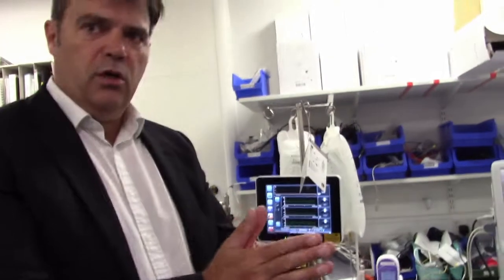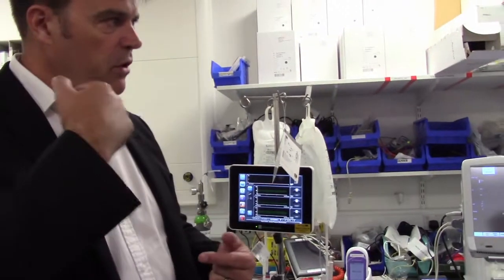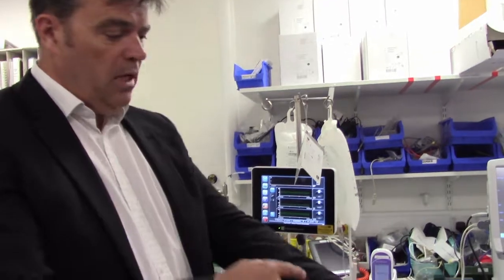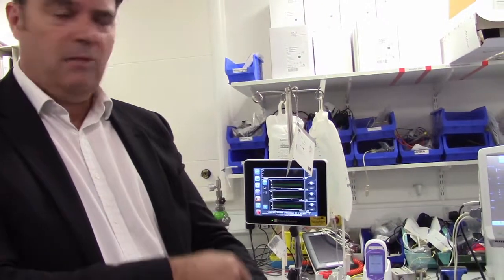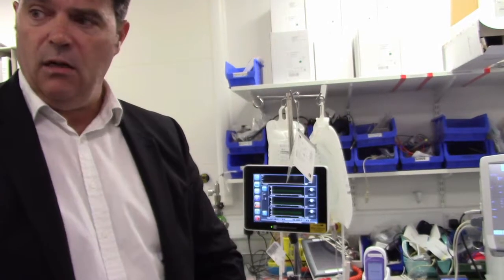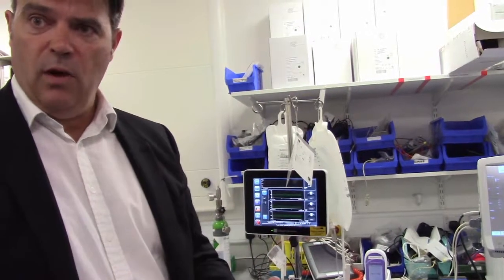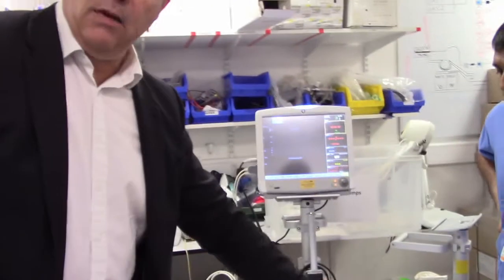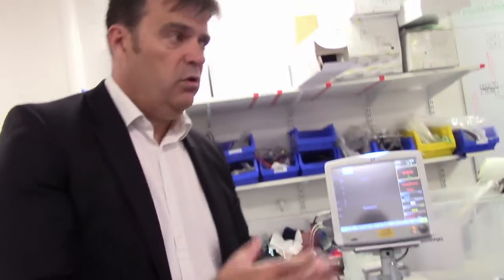A lot of it is to do with indicator dilution, because it's the time of transference from injection to measurement. The other reason is that this particular model is for much sicker patients who can peripherally shut down, and when they do, using a radial catheter becomes less reliable. So having a central line with a better quality signal improves the signal in those types of patient group. You can use this in exactly the same way as a standard arterial line. The only difference is that you're looking after it a bit more.